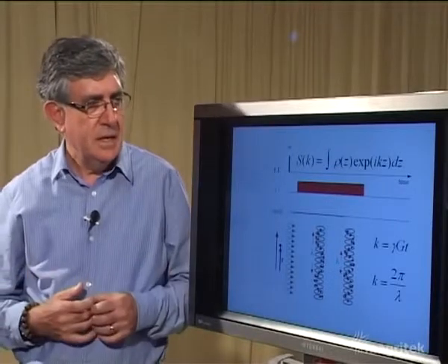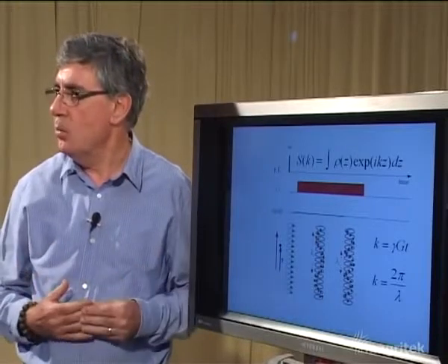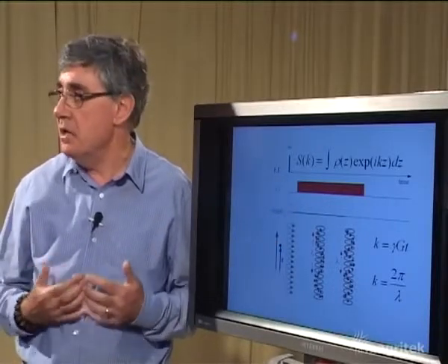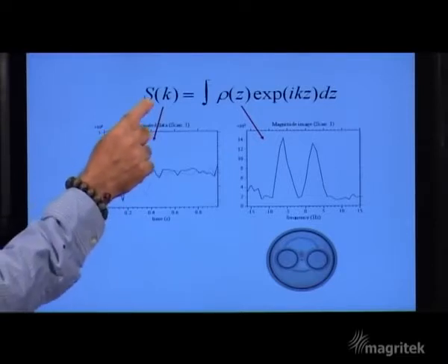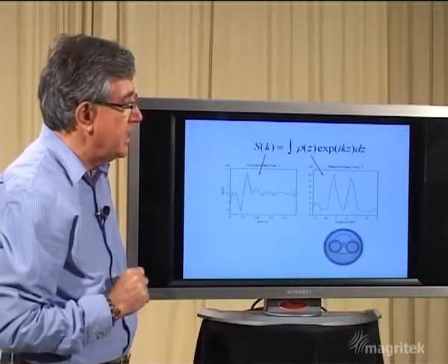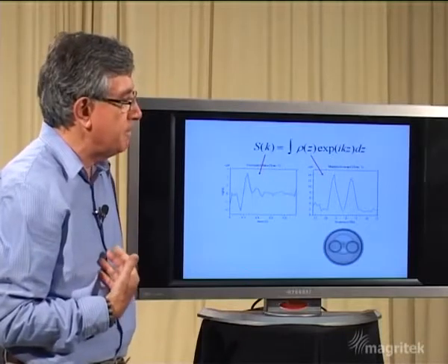Of course, the signal we acquire is not the thing we're really interested in. What we're really interested in, in imaging, is this spin density function. That's what we saw when we looked at the one-dimensional imaging experiment with the 2 tubes of water. The signal we acquired in time also corresponds to a signal in k-space because k is proportional to time. And when we Fourier transform that to get the frequency domain, we obtain the image.